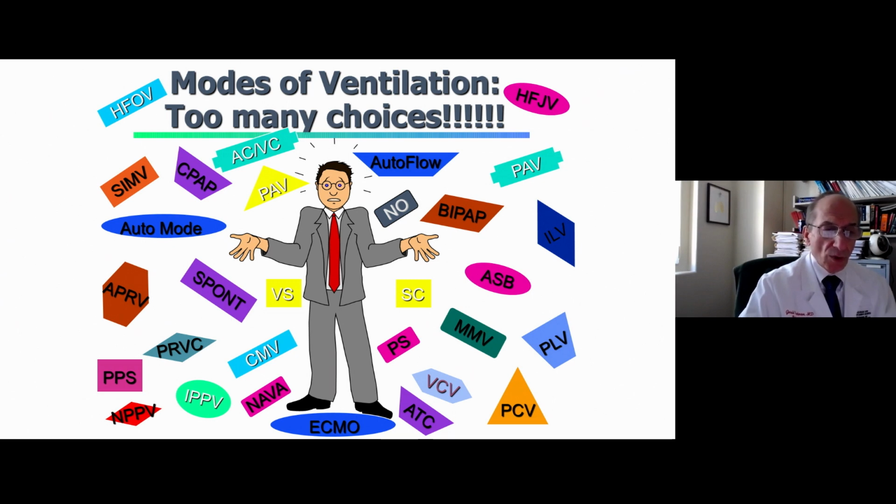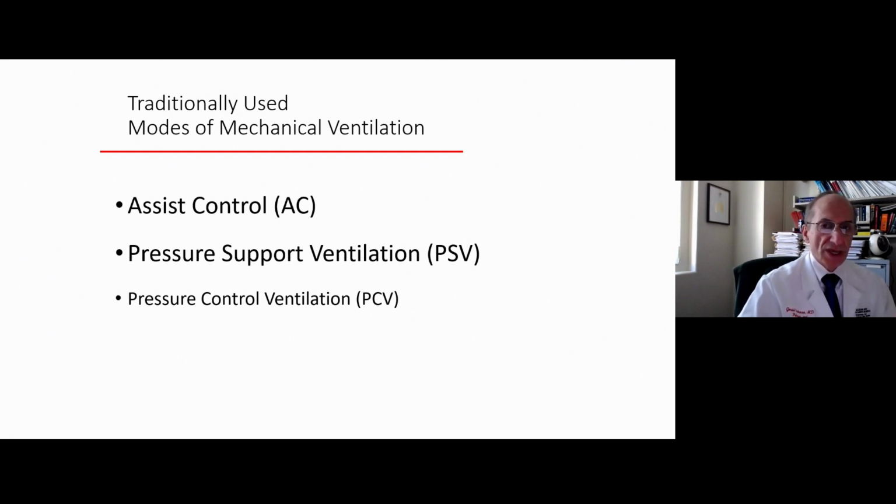Now, I want to disavow any notions that the actual mode of ventilation is that important. I know that people get very concerned about it. There are many, many modes of ventilation. Most of them are proprietary. They're almost all variants of the same thing. I just want to make sure that you understand that there are really three modes of ventilation that are overwhelmingly used for the overwhelming number of patients. So those are the only three modes of ventilation I will talk about today.